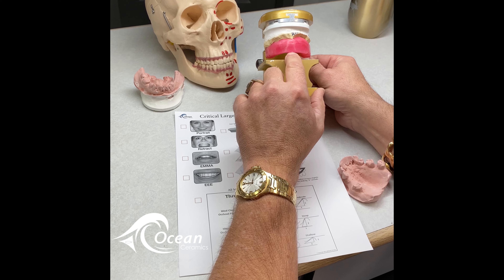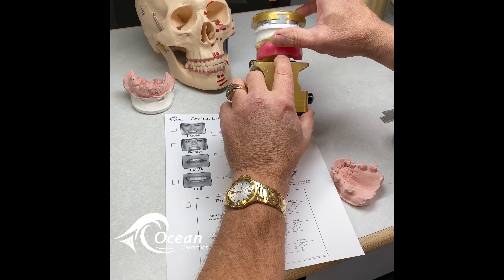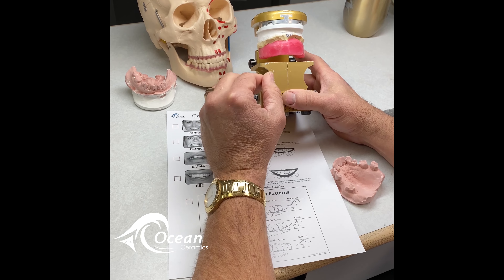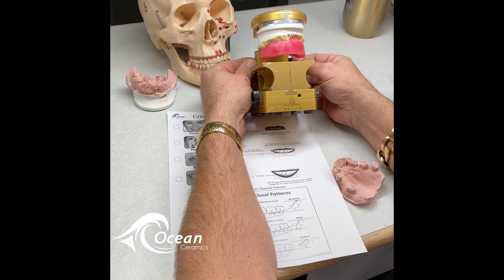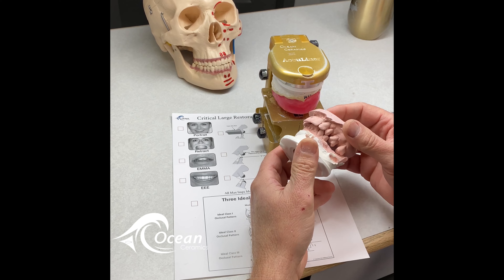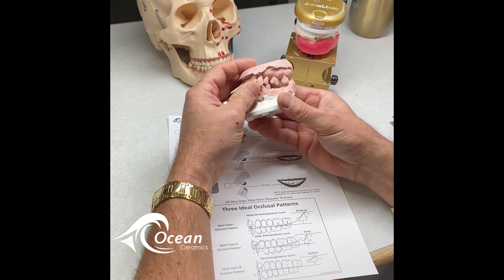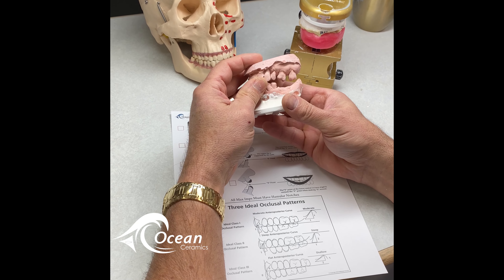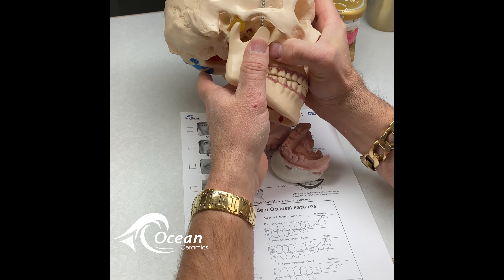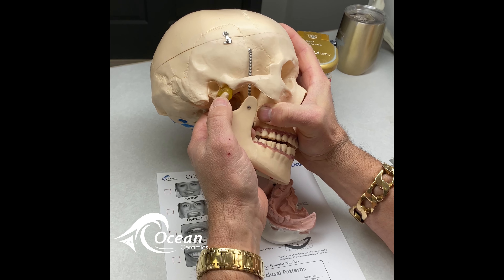Then take these key pictures, which will tell us if we have a correct occlusal plane. This one shows us the occlusal plane; this one shows us what the existing occlusal plane is, retracted. This one shows the tooth display with the lip at rest, and this shows how high the lip line will go with a big 'E.' Whether you've got teeth in place or a bite block, it's absolutely essential to take these pictures with the bite block in place as well.